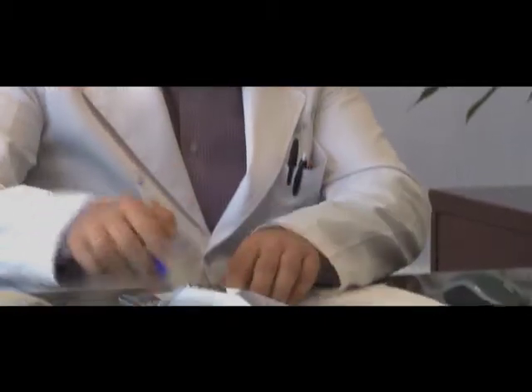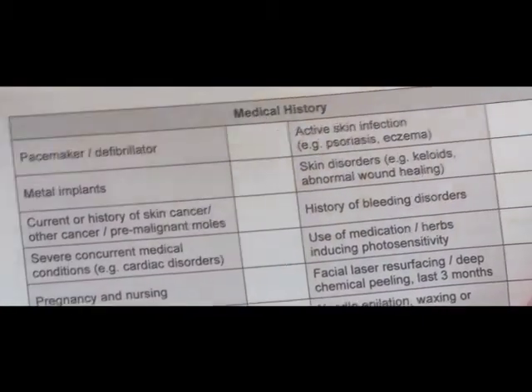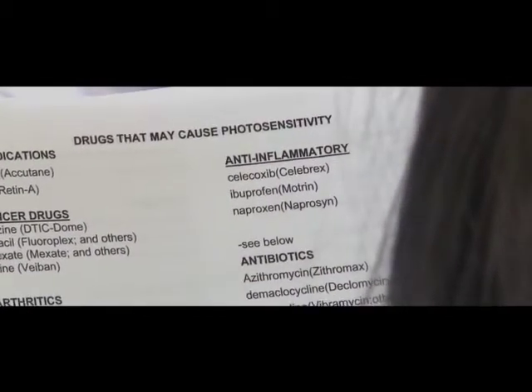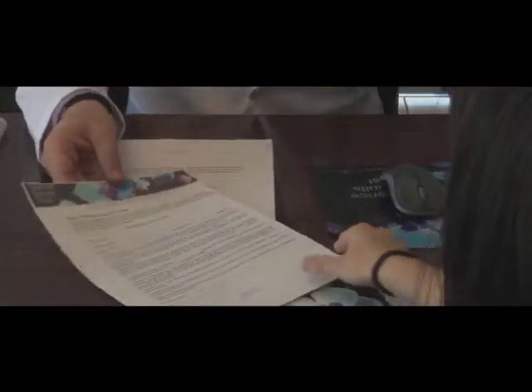For any laser treatment, it is important to have a complete initial consultation with the patient to review the patient's medical history, including medications. Select the proper skin type of the patient, complete a physical examination, review contraindications, and discuss the treatment process. Establishing appropriate and realistic expectations prior to the treatment is important. The informed consent should be reviewed and signed.